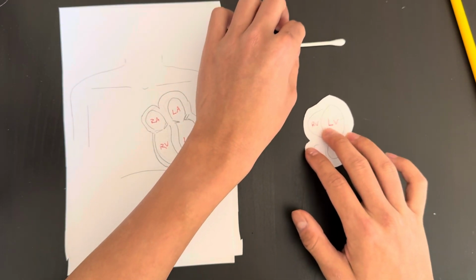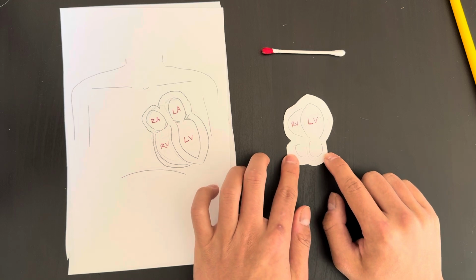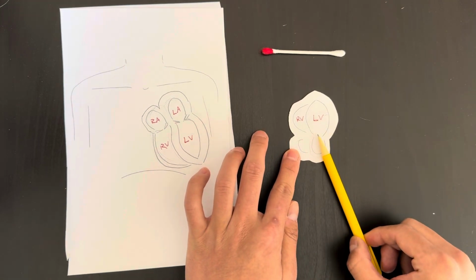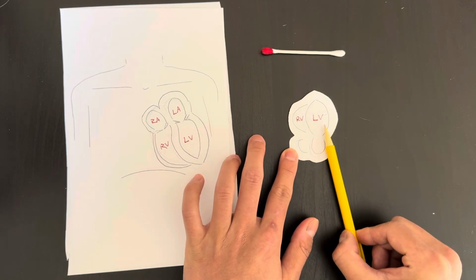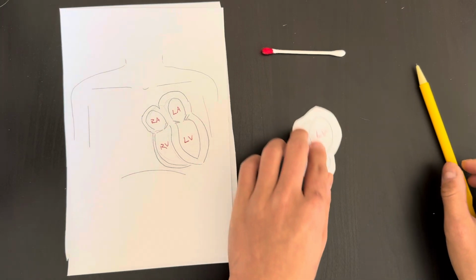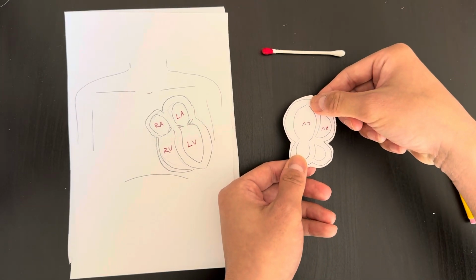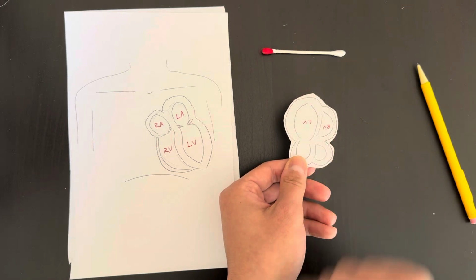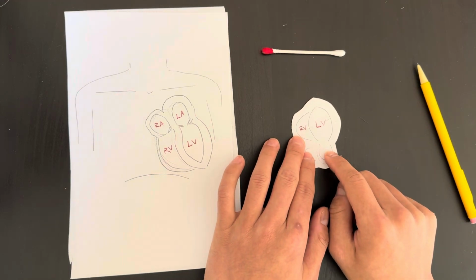Apical 4 chambers, again, whether you're radiology, emergency, cardiology, any specialty, you want to see it in this format, right? Where the LV is on the right side and the RV is on the left side. And you can imagine if someone showed you the opposite, you'd be very confused and be like, wow, that is a big RV, when in fact, we're just looking at the LV, okay? This is the orientation you want.